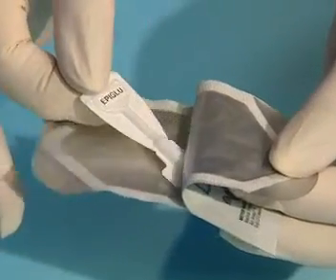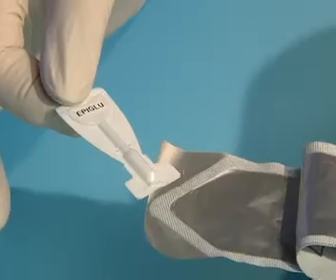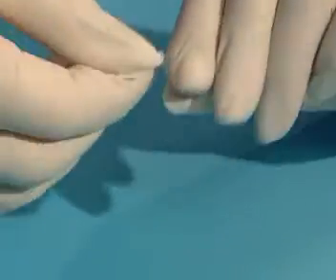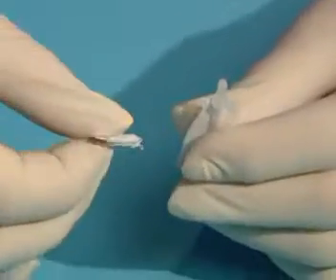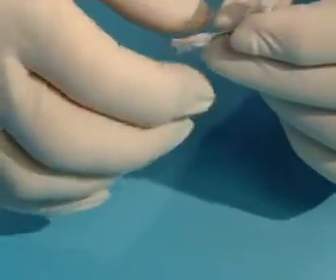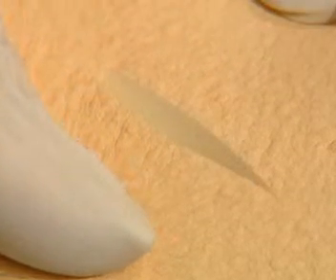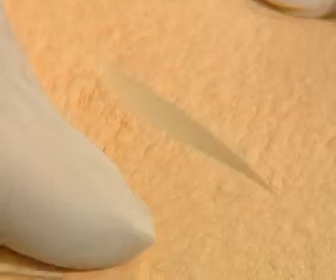The peel-off pouch gets opened and the dosette is taken out. Hold the lower part of the dosette and screw off the upper part. The drip opening of the dosette is held downwards and Epiglu can be applied to the adapted wound by slightly pressing the filling body. With the even surface of the twisted off upper part of the dosette, the adhesive can be smoothed out thinly on the wound.